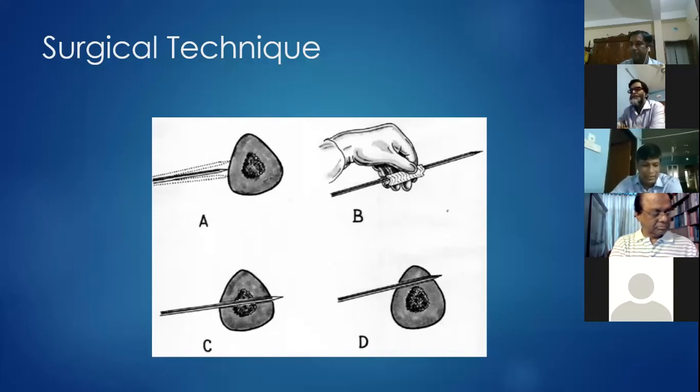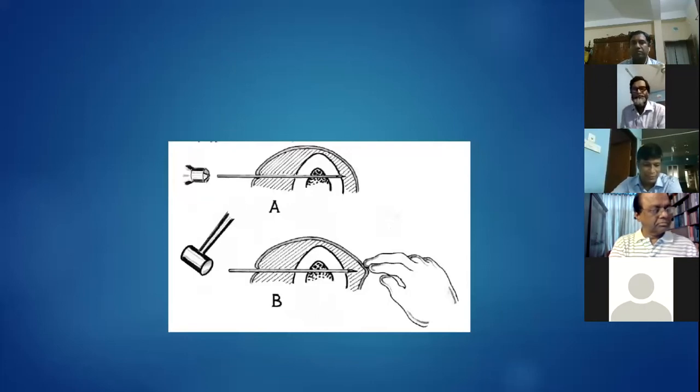After passing the far side of the cortex, the drill is disconnected and wire insertion is completed by hammering with light taps to prevent perforation of the major vessels and nerves. At this time, when the wire tip approaches the surface, the skin at the exit site must be manipulated in the same direction as at the entrance site. Wire insertion is continued until the amount of the wire is approximately equal on both sides. In case of an olive wire, a 0.5 centimeter skin incision must be made at the portal of the olive stopper wire with a number 11 blade.